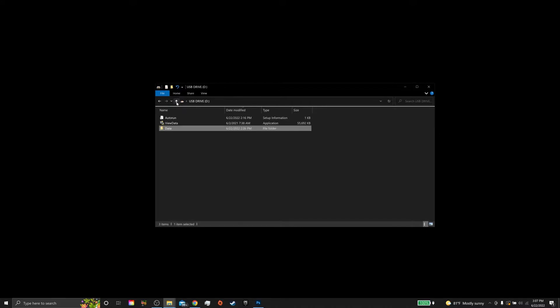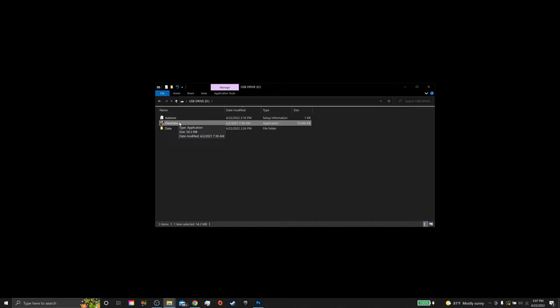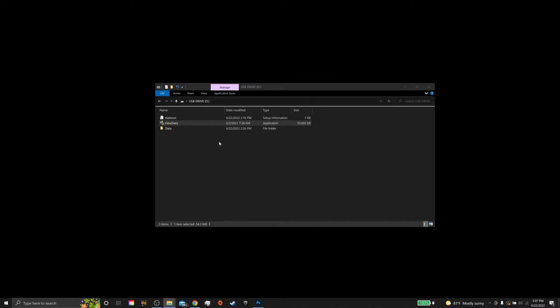The other way is to use the Simple Viewer that's already on the thumb drive. This Simple Viewer allows you to install a light version of our 3D viewing software. This version is intended to be used on any computer, regardless of your existing specs. I'm going to go ahead and install that now.